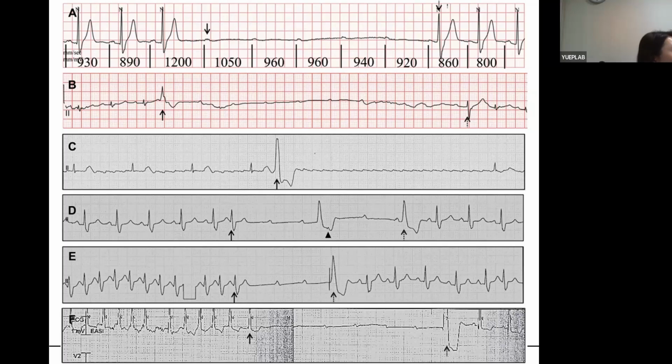I operated on a single point, yes, for PVC. However, two distinctions appear. Right. Yeah, I think that's probably the same focus actually.